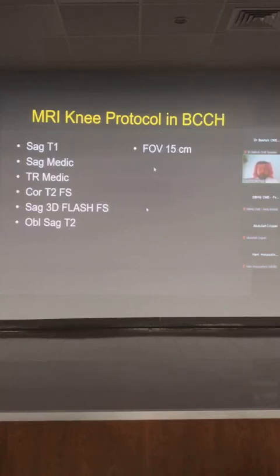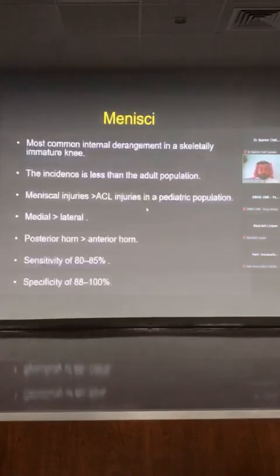And we keep the field of view to 15 centimeters. The field of view is important. Sometimes if we use a very large field of view, we can lose resolution in the images. So we have to keep the field of view appropriate to the patient size, so we can get the best image quality that we can.